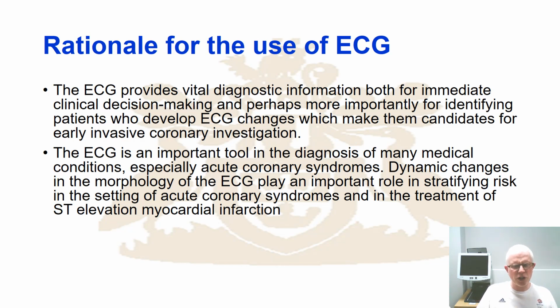So we know, for example, acute coronary syndrome, but also the fact that you can now monitor this electrical activity of the heart, and the fact that, as you'll see, the change in the electrical activity is linked to the activation and deactivation of key structures and therefore key responses, means that you can start to understand the dynamic changes in the morphology of the heart. And so you can start to really understand if there have been adaptations or limitations to the heart. In other words, you can stratify risk. And you can stratify risk in terms of acute coronary syndromes.